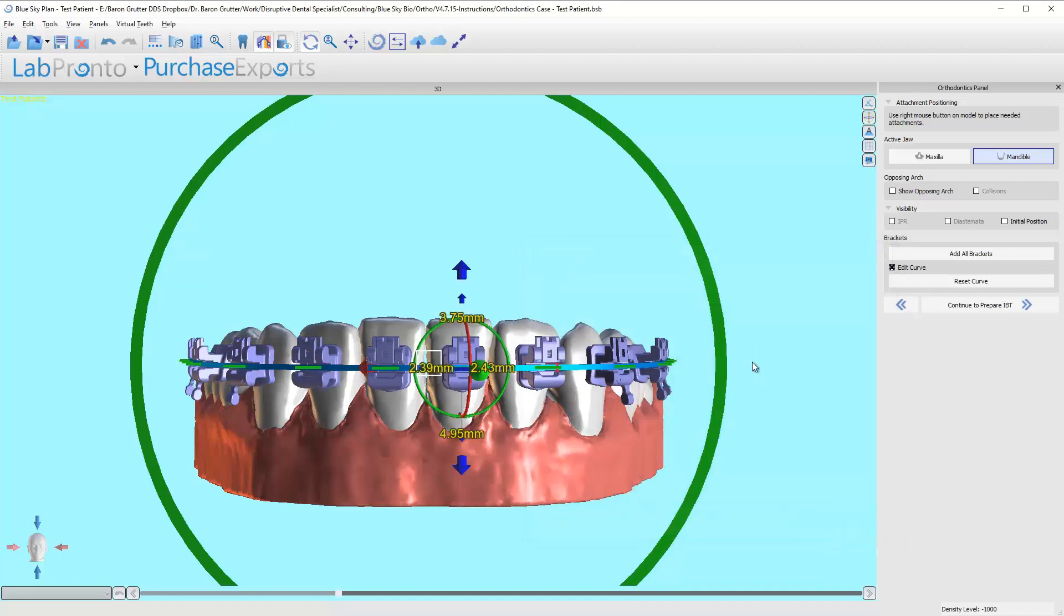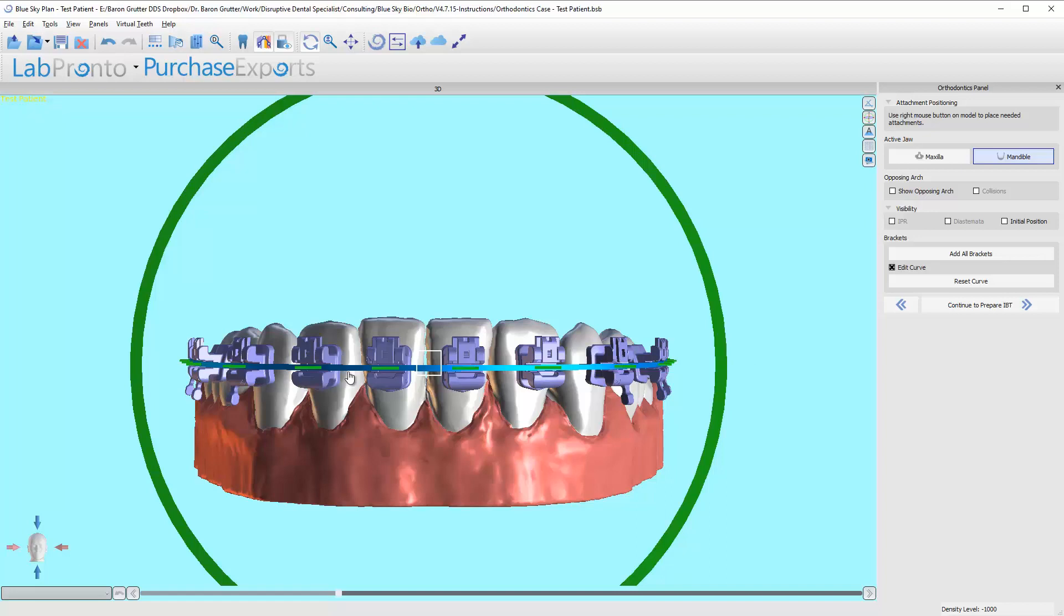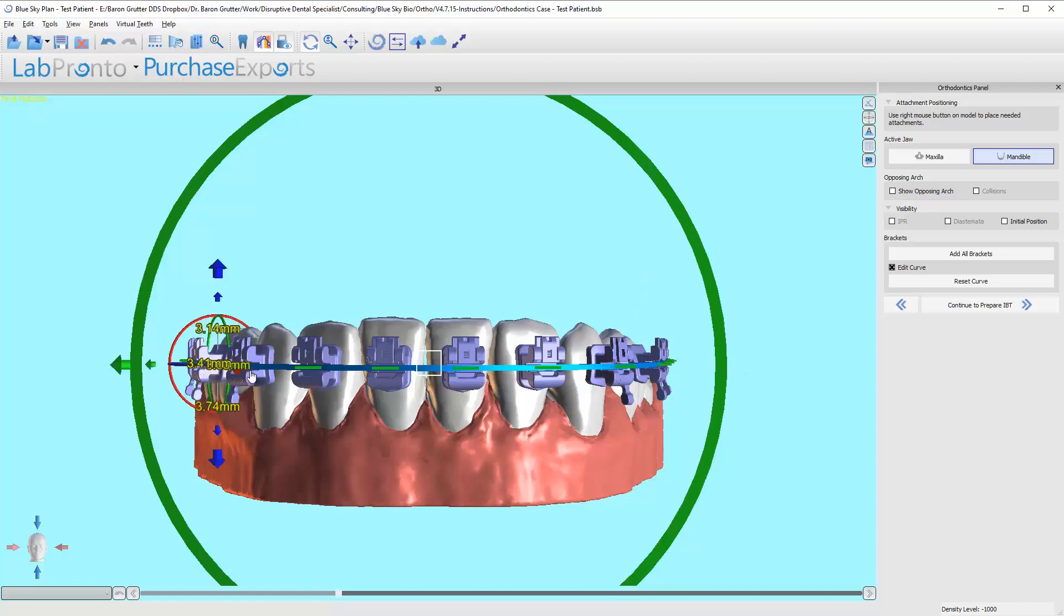Click add and all the brackets are automatically aligned, positioned. Notice something: all of the brackets, the channels in there, are lined up to the wire as though they are on the same plane.